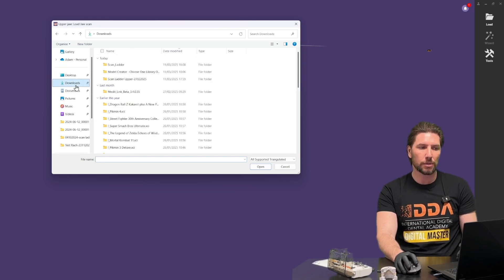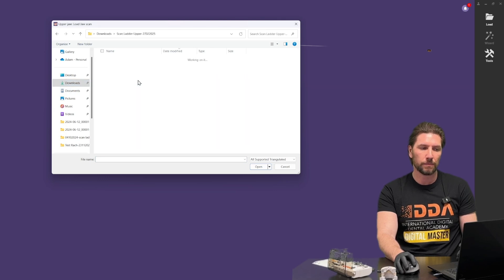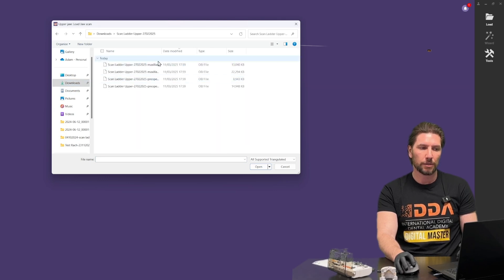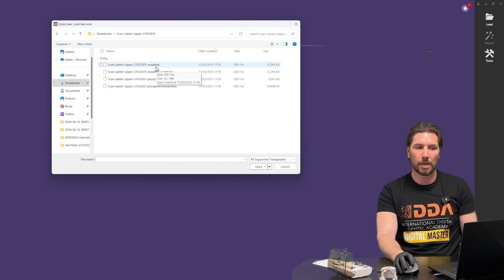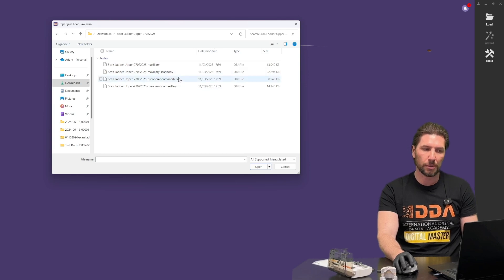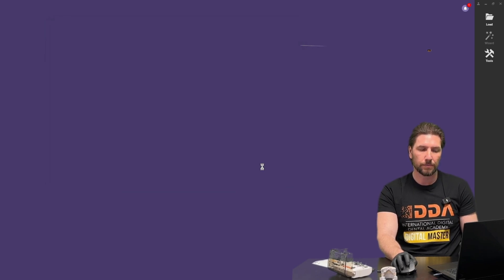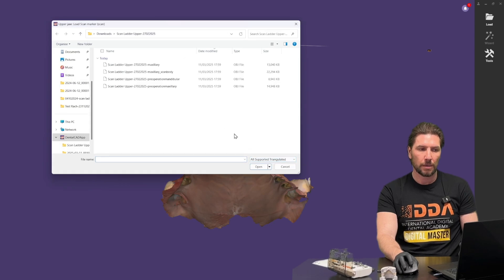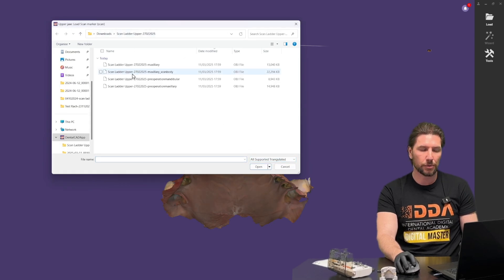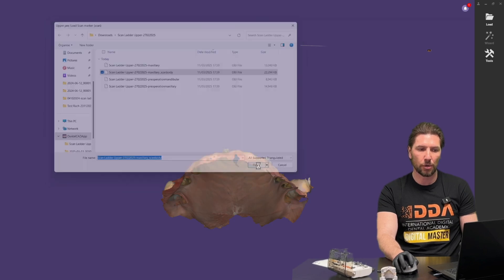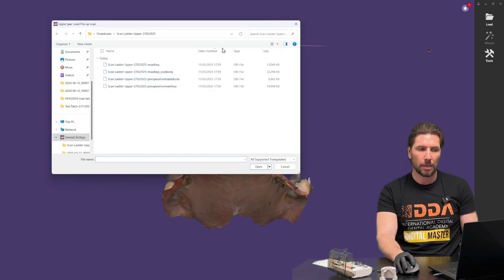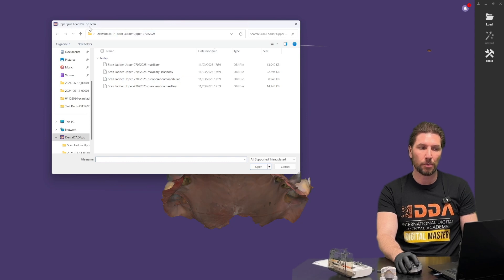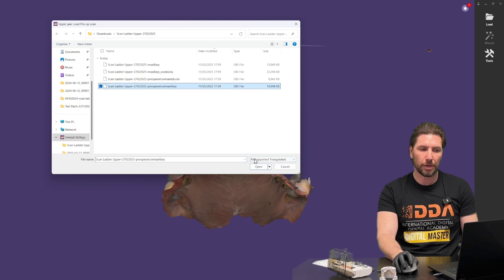So let's go to the location we saved those to. You can see if I widen this out a little bit we have maxillary which is the gingival scan we're going to bring in and the scan body next and also the pre-op. So let's bring in the maxillary first and then it's asking us to bring in the upper jaw scan marker. So you can see from edit we've exported this maxillary scan body. I'm going to click open and then finally it's asking us to bring in the upper pre-op scan.